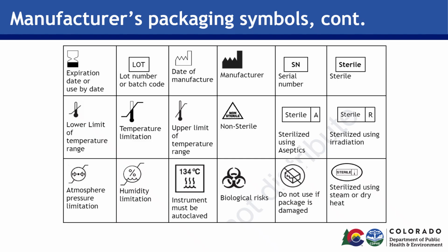We point this out because there are individuals that may carry their surgical scissors around for various tasks, but if you look closely at them, they may have on the scissors themselves where it shows a temperature and that it needs to be autoclaved between uses. For similar items, be sure that they are being consistently used per the instructions for use.